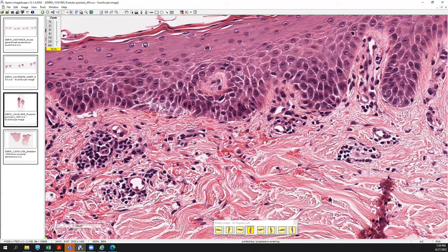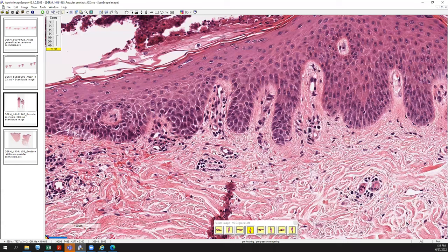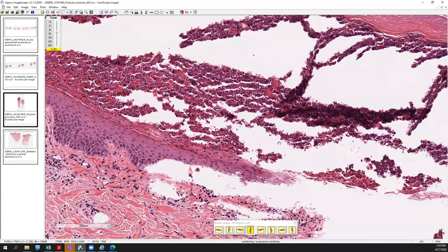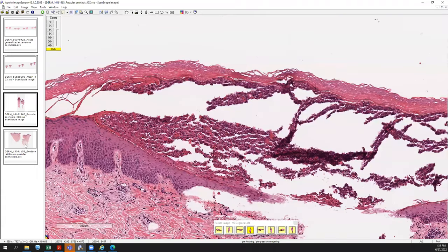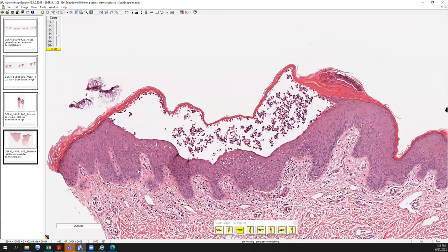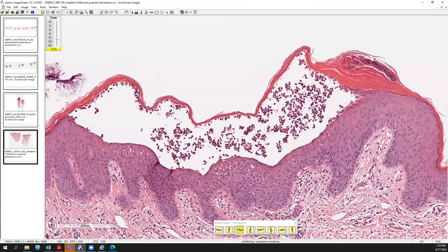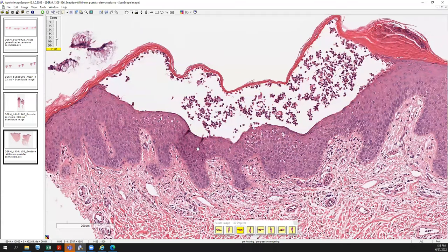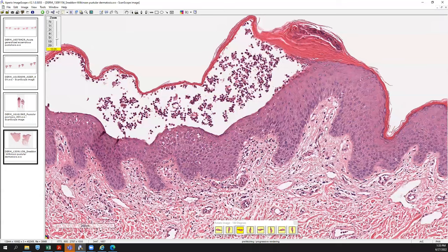On an exam, they wouldn't give you a pustular psoriasis with a ton of eosinophils because that would be too confusing to separate from AGEP. So this is a really nice example of pustular psoriasis. Now there's an entity that can look very similar to both of these — Sneddon-Wilkinson pustular dermatosis — which has that same pattern of subcorneal neutrophilic pustule formation.